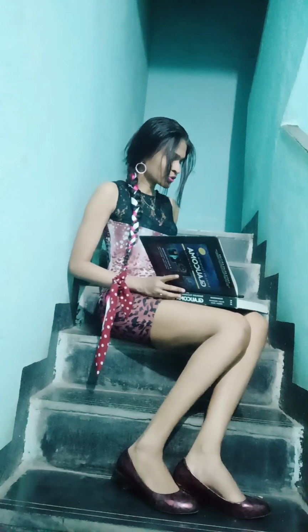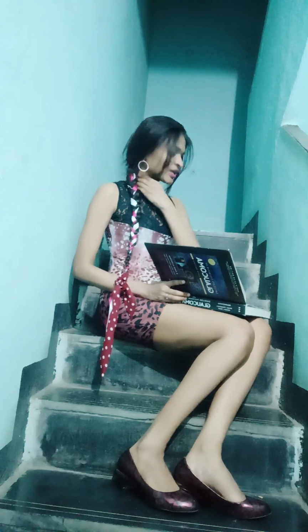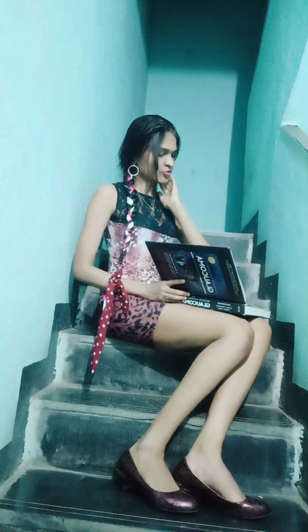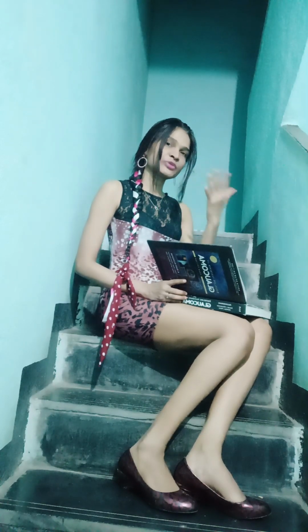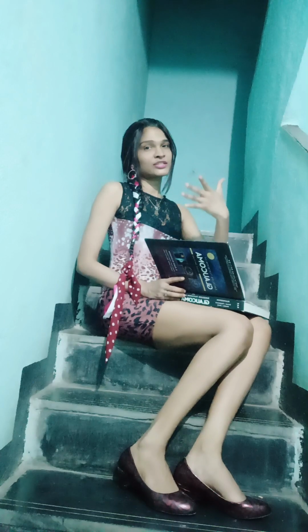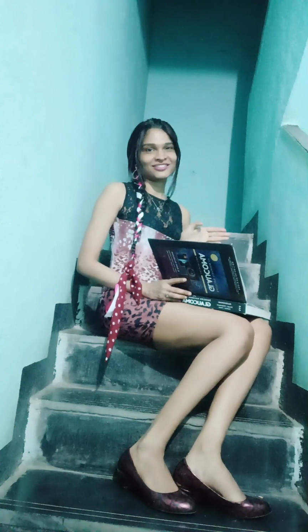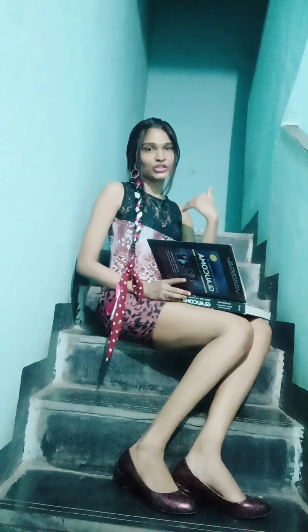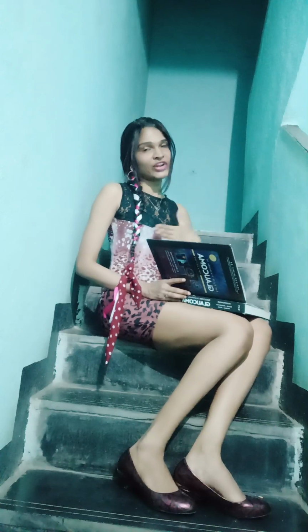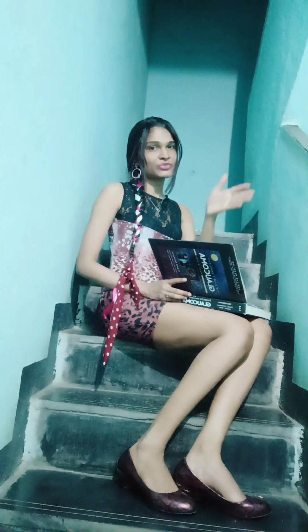Okay, so direct gonioscopy. The Koeppe lens is a prototype of direct gonioscopy, and it is available in different diameters and posterior curvatures. The gonioscopy lens has an anterior curvature that is steeper than the anterior curvature of the cornea. Why? To decrease the angle of incidence below the critical angle, so that the light rays are not reflected back into the denser medium and are instead refracted into the rarer medium, that is the air medium.